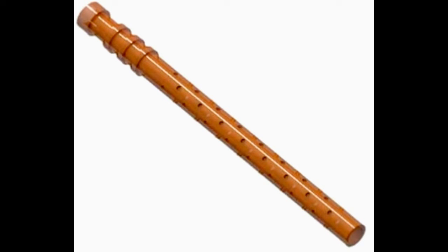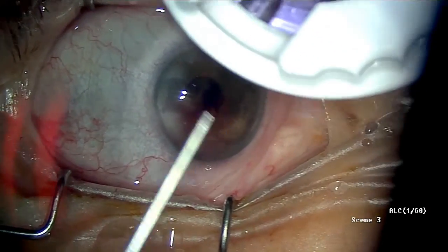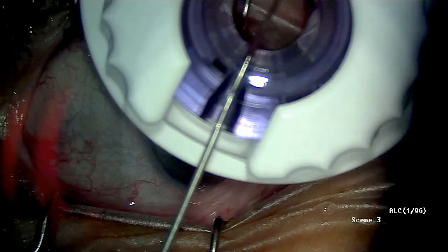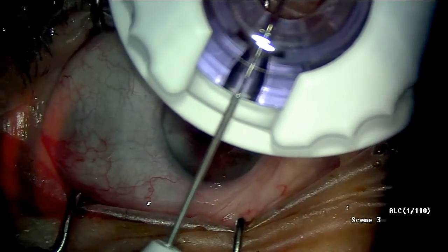What you see here is the easy-load cartridge, which the stent comes in, along with the insertion device, which has a blunt retractable guide wire. A click of the button loads the stent onto the guide wire.